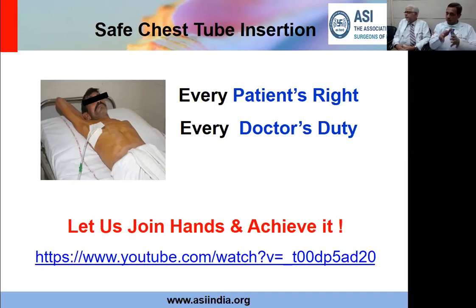More important, and this is something we see more often, because most of these patients will have some reason or other to put a chest tube: once you have put a chest tube, you don't remove it in a patient who's still on a ventilator or has a possibility of going on a ventilator. So a patient who is on a ventilator or may go on a ventilator, even if he's meeting all other criteria for removal of the chest tube, you will hold on until the patient comes on spontaneous breathing. Reason: if this patient on a ventilator has any amount of pneumothorax, it will convert into tension within a few minutes. And that is the reason why, if the patient is on a ventilator and has a chest tube and has any air leak, clamping the tube is a big no, because you will immediately precipitate tension. All right.